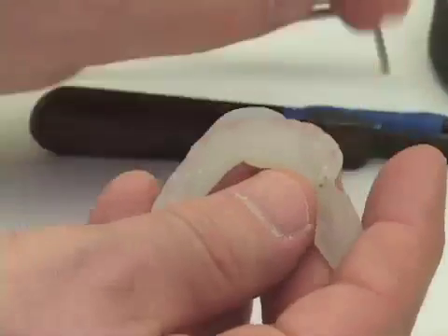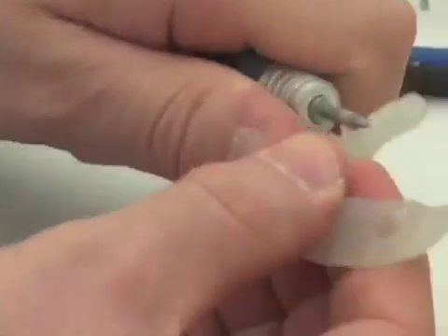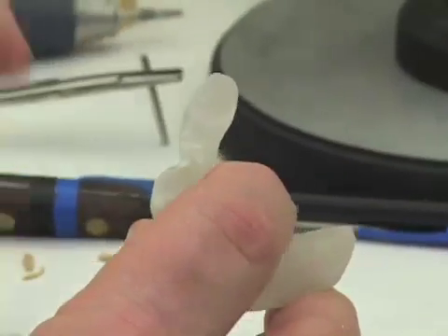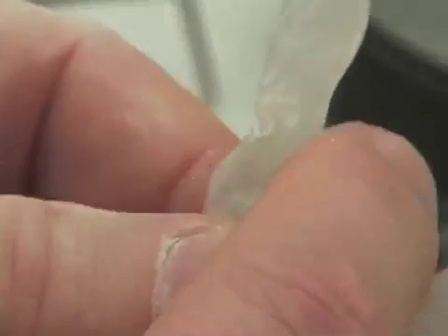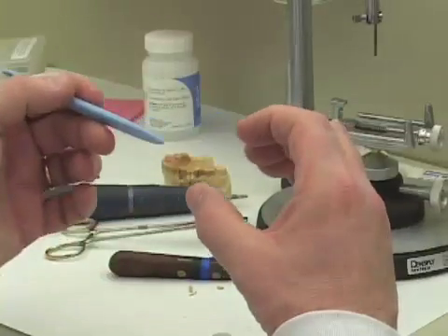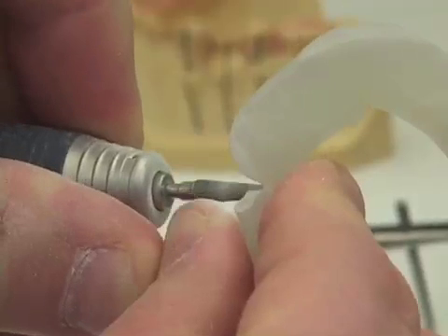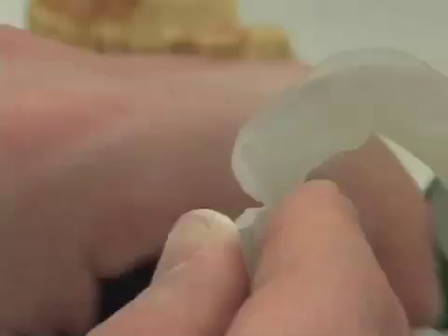What I'm now going to do is take our slow-speed straight handpiece and relieve any sharp areas that I feel with my finger. What I try to do is look in the long axis right down the drill guide, and you can see that where the triad surrounded the lingual 180 degrees of the drill blank, it actually went more than 180 degrees, so there's a constriction. What I'm trying to do with my drill now is just open up that constriction so that my drill blank can freely pass in and out from the buccal and not be constricted at that narrow aspect.